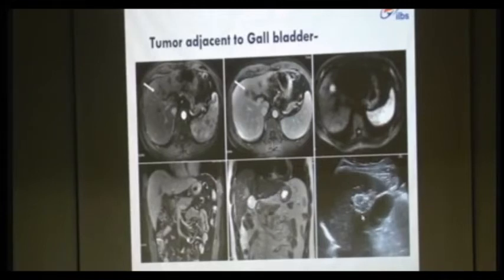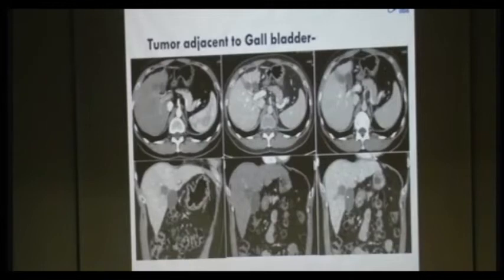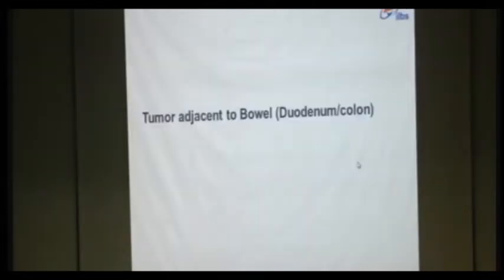When the temperature reaches near the gallbladder, we aspirate the bile content from the gallbladder to prevent injury to the gallbladder wall. And this is the follow-up image, which shows complete non-enhancement in the whole of the lesion without any injury to the gallbladder. This coronal section also shows no obvious enhancement in the whole of the lesion without any injury to the gallbladder, suggestive of complete response.